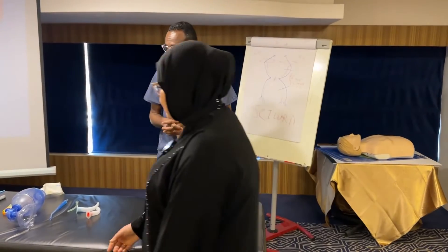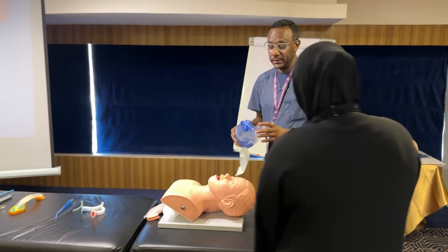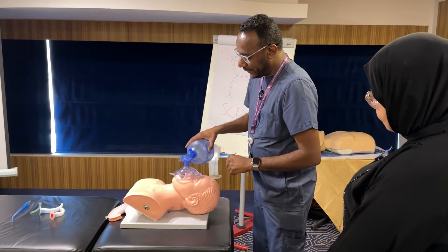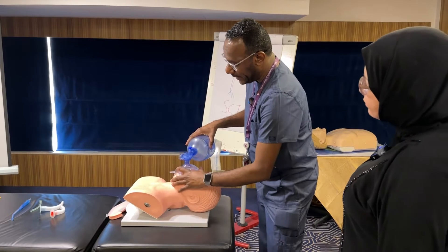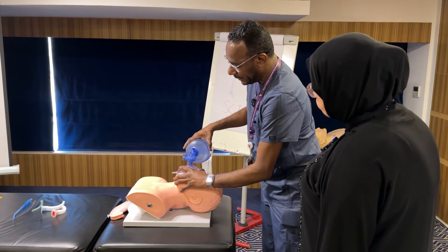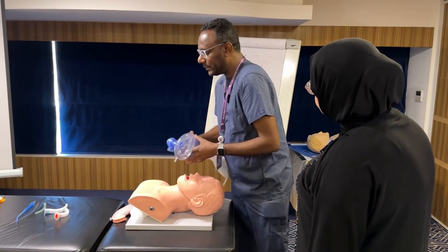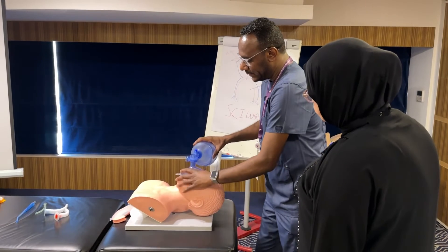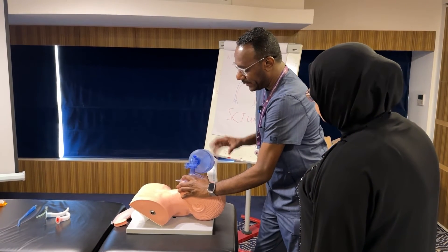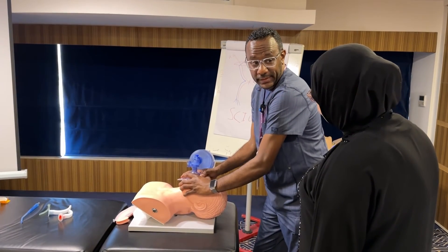I want to know how to use that. The bag-valve mask — this is really important to provide positive pressure ventilation. You can use it one hand or two hands. Apply it to the face like this and keep a tight seal — bring the face to the mask — and do a little bit of jaw thrust, then ventilate. If it's not working, you can put an OPA or nasopharyngeal airway and repeat. You can also use it two-person: one person holds the seal and the other ventilates, while assessing chest rise and end-tidal.